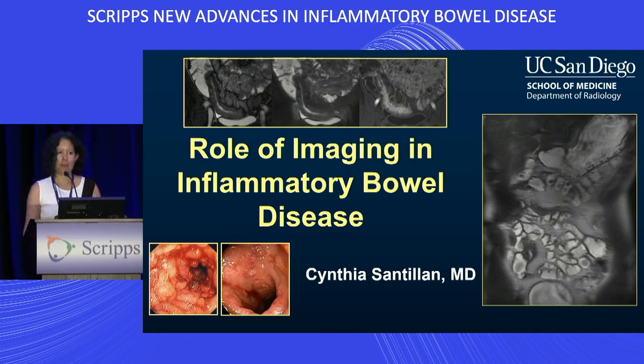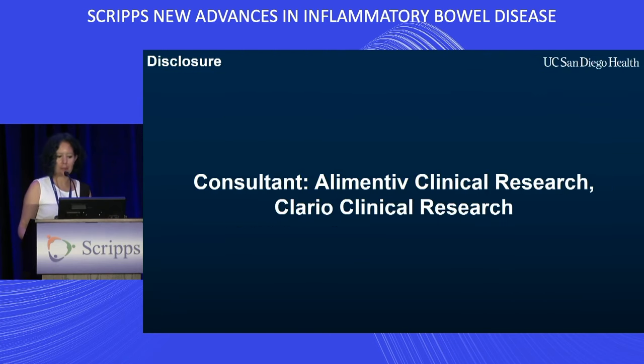So we're going to talk mainly about MR in this talk. I know that we have an ultrasound talk to follow, so we'll have an opportunity to learn more about that there. We'll touch a little bit on CT, but I think that we all recognize that MR is being more widely and more commonly utilized for evaluation in these patients for various reasons. So most of this is going to be centered on MR, but some of the principles can also apply to CT.